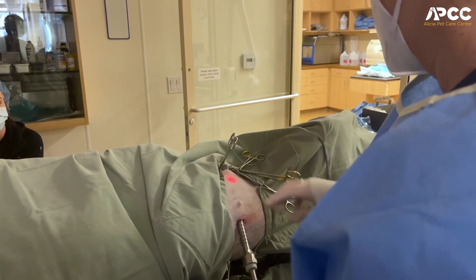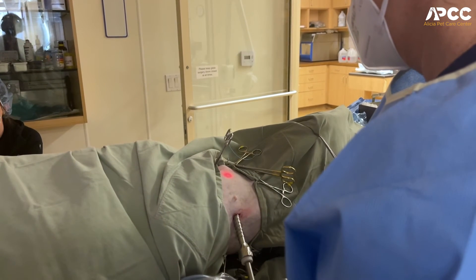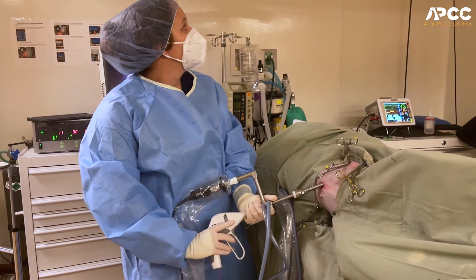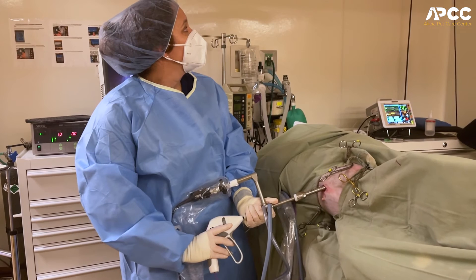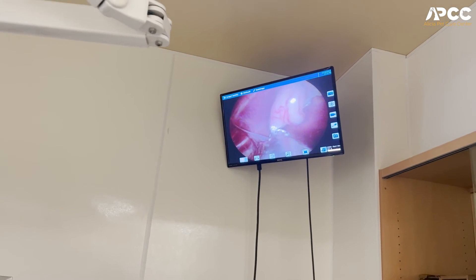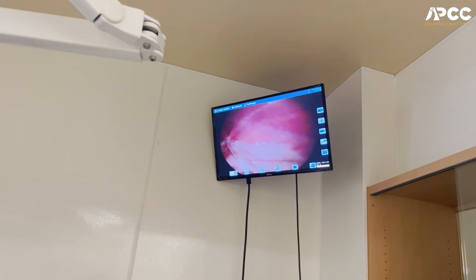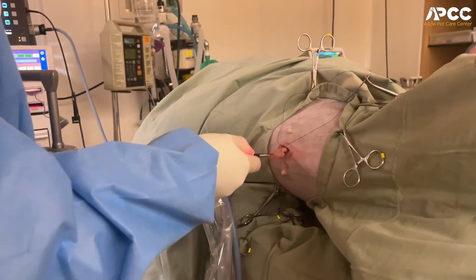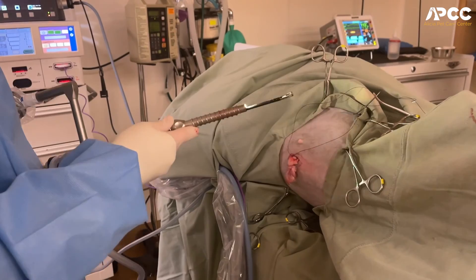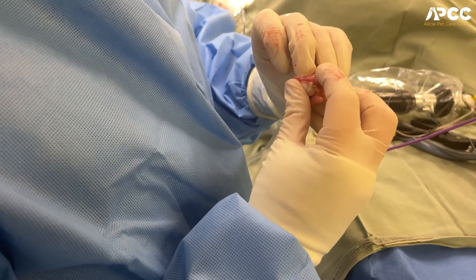Then we isolate the ovary — we can see everything visually with our camera — and we insert a tool called a force triad, which is an electrocautery and cutting instrument. With this, we're able to visually remove just the ovary. The electrocautery helps make sure that there is no bleeding from any of the blood vessels. Then we repeat the same procedure on the other side, and we remove the ovaries from the abdomen.